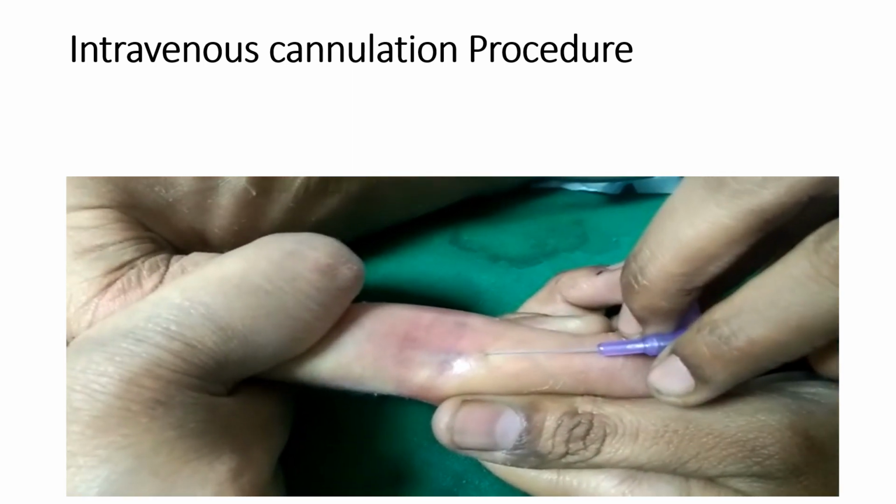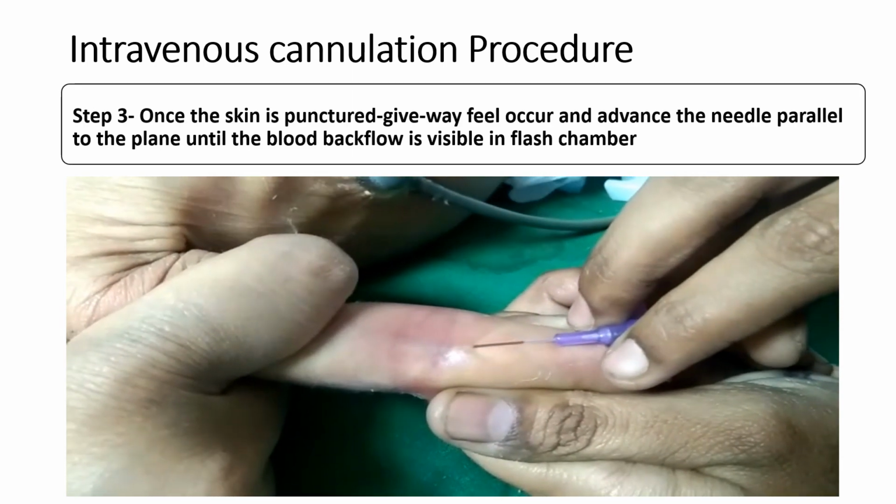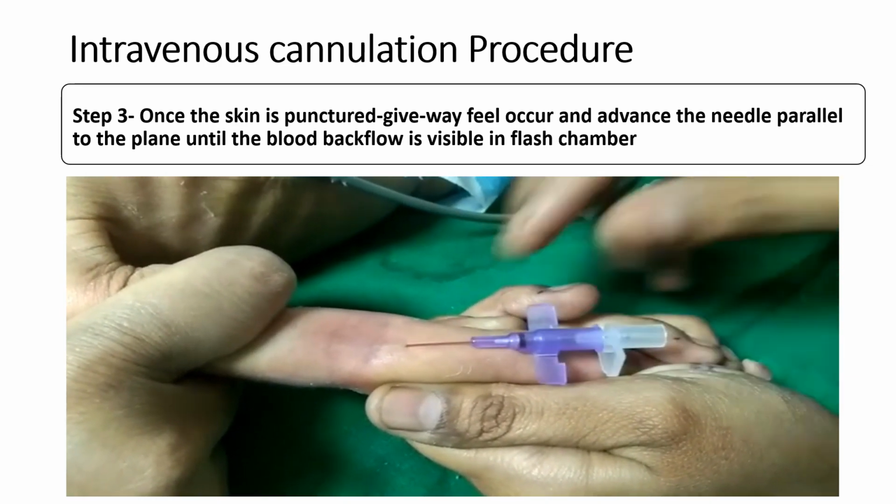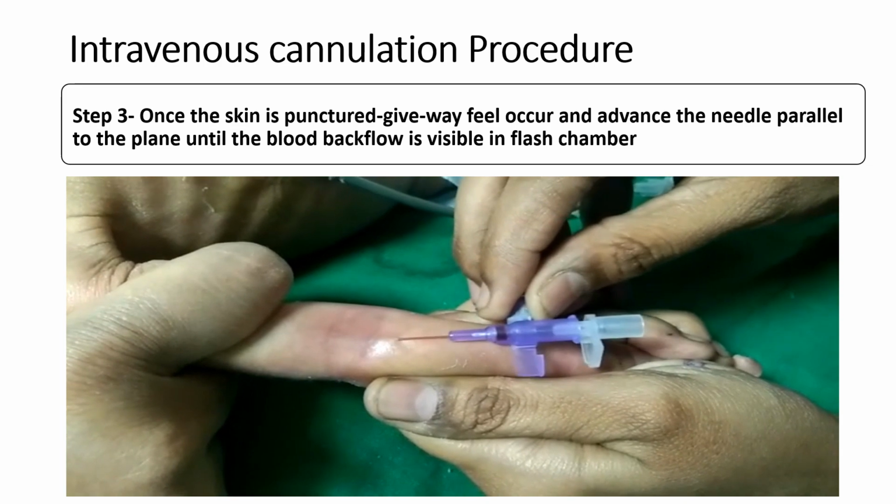Now in this video you can see the third step. Once the skin is punctured, a giving way feeling will be there. You have to advance the needle till the blood backflow is visible in the flash chamber.